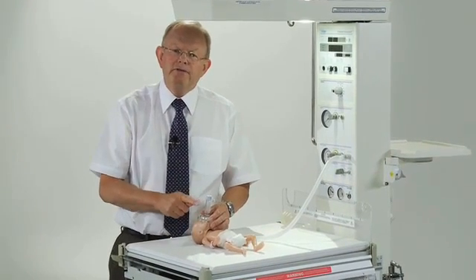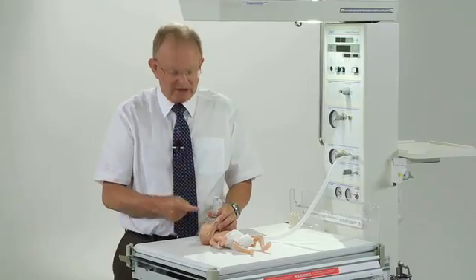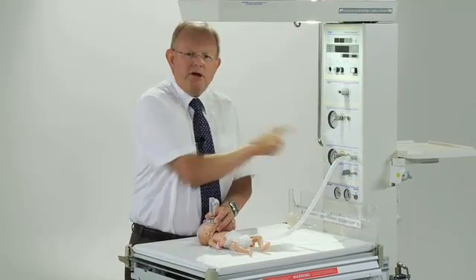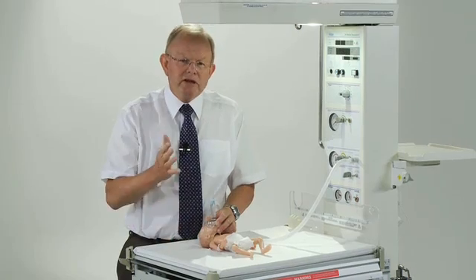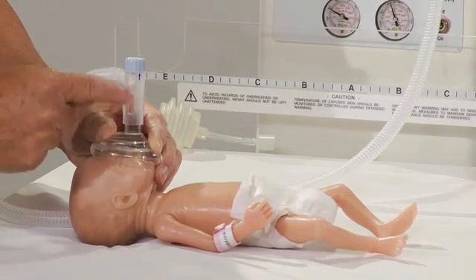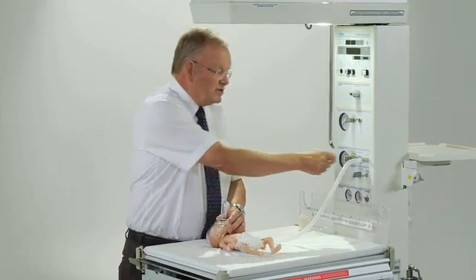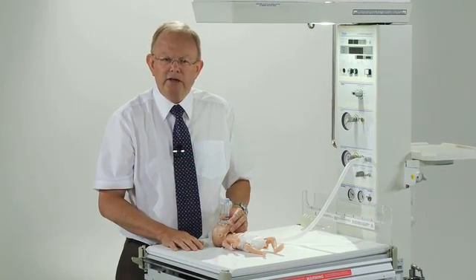Traditionally we've used pressures to ventilate babies at birth and also in the nursery. But really what we're trying to do is get a volume of gas into the baby — the tidal volume. During neonatal resuscitation we set a pressure — I set the pressure here at 30 centimetres of water — but that's a guess. We really don't know what the right pressure is. So I propose that in the future we need to have a little flow sensor here that will measure the volume of gas going in and out of the baby, so that when we can see the tidal volume, we can adjust the pressure to get the tidal volume at the right level, which is roughly 5 mils per kilogram body weight.